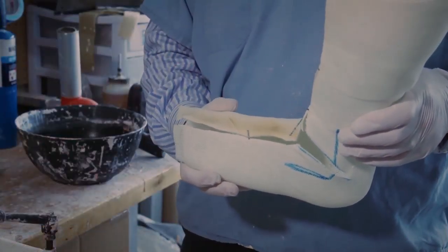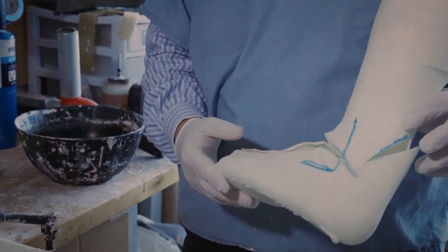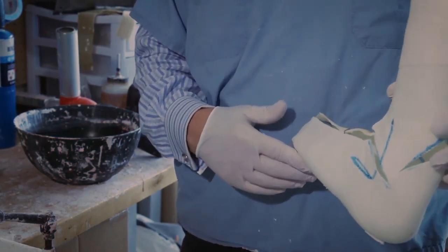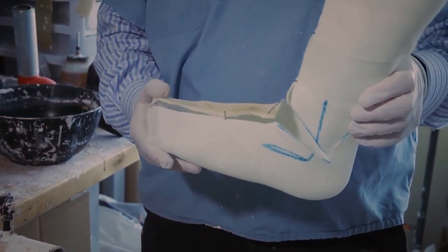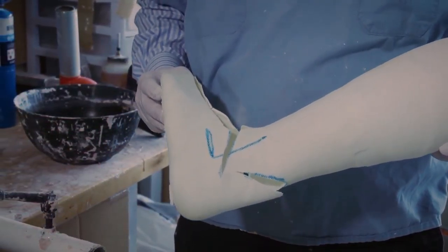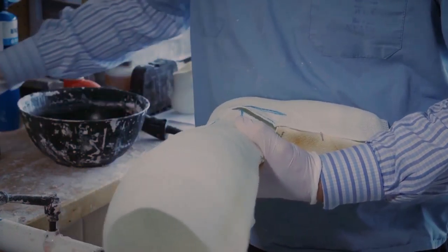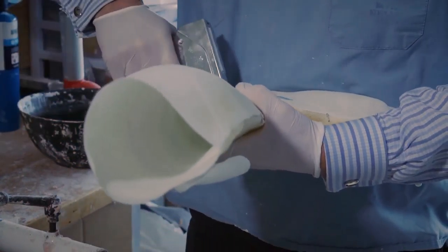We are now in the plaster room — not everything is squeaky clean in here, but there's a lot of good work that happens here. I'm going to go through the process now: this foot is plantar flexed and we need to get it to 90 degrees. It doesn't just stay there by itself, so an orthotist will get it close to 90 degrees.